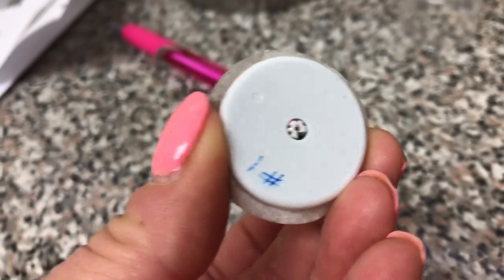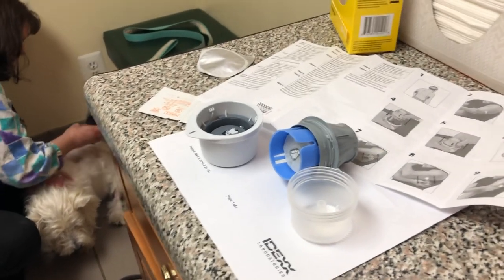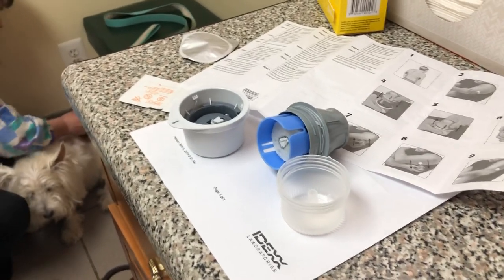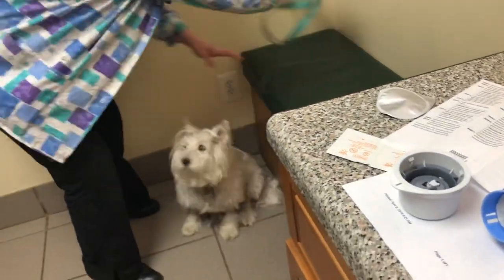And then you can use your phone to scan it and get your readings up to every minute, and it lasts 14 days. So it's a great option for our new diabetics who are trying to figure out the magic dose, or if anybody's at home and they're worried their dog's or cat's getting too low. So we're gonna shave a little spot. She's gonna start to look a little bit like a giraffe on the table.